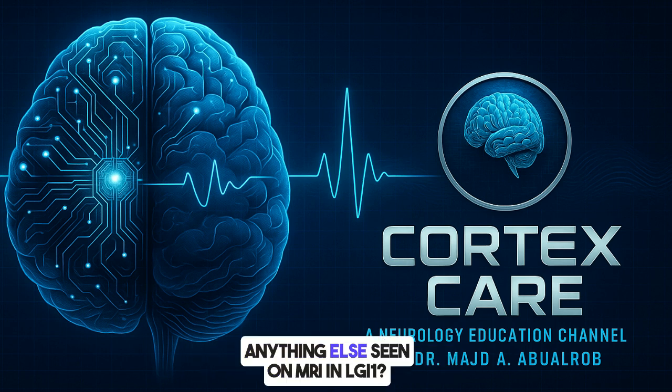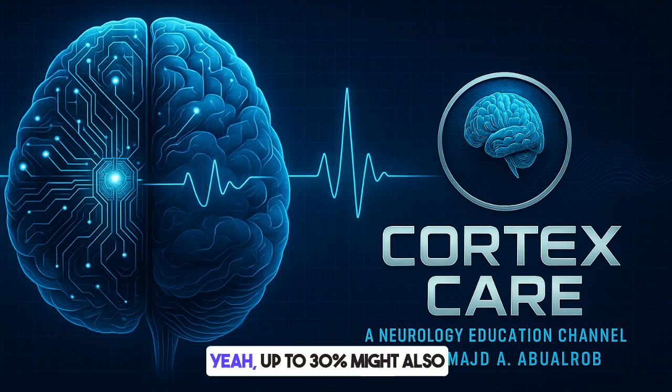Got it. Anything else seen on MRI in LGI1? Yeah, up to 30% might also show T2-FLAIR hyperintensities along the corticospinal tract, that main motor pathway. Okay. What about long-term MRI findings in LGI1? Does the initial picture predict the future?